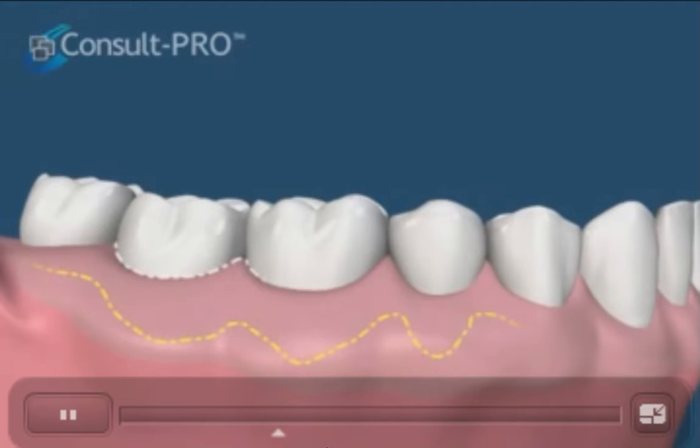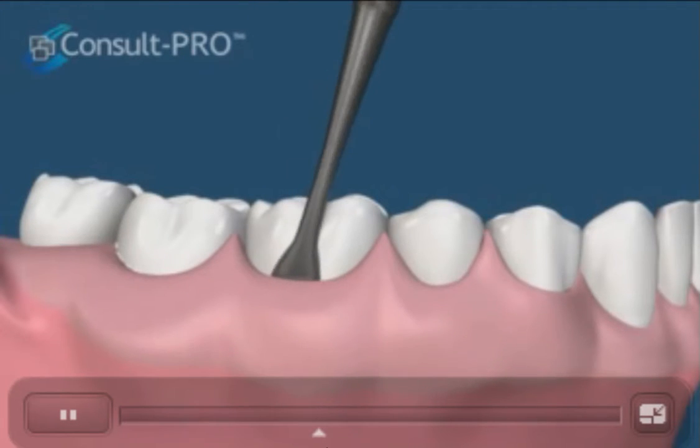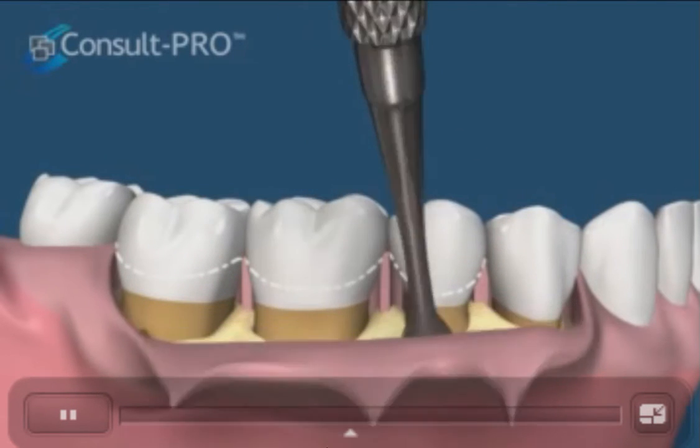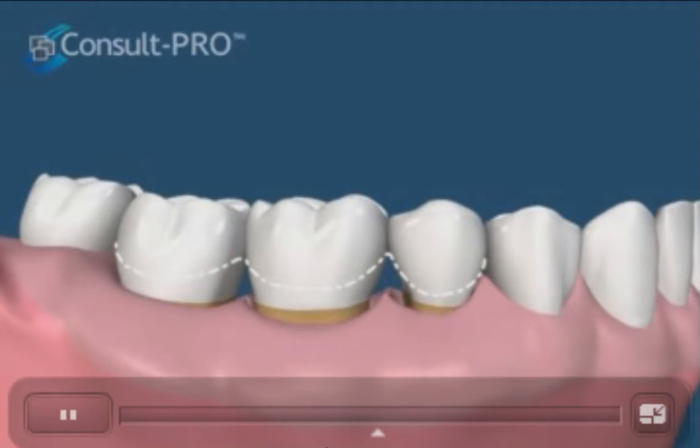The procedure begins with incising inside the pocket itself and then retracting the gums with a periodontal elevator. The gums are then repositioned lower on the tooth and sutured into place. Notice the white outline of the original level of the gums.